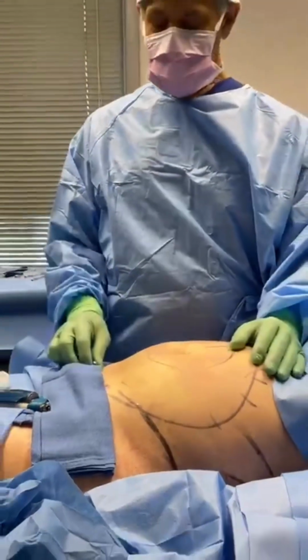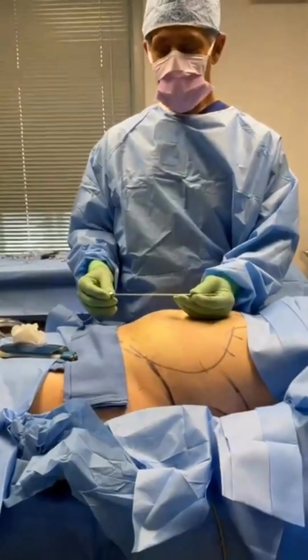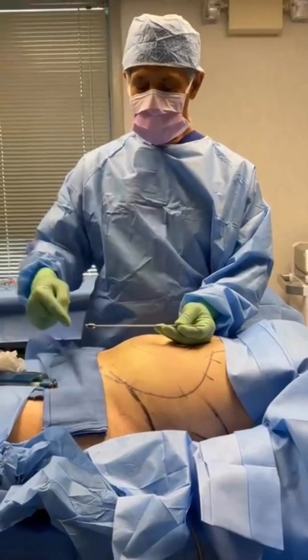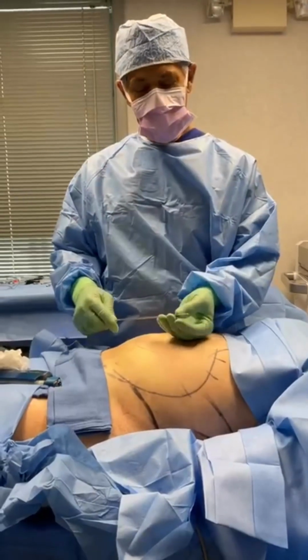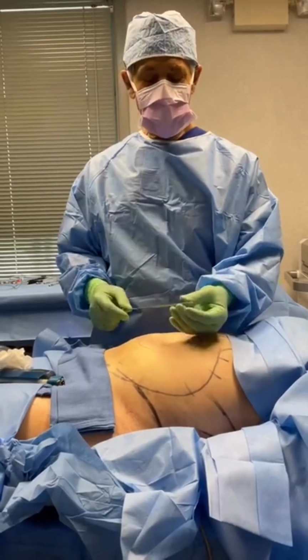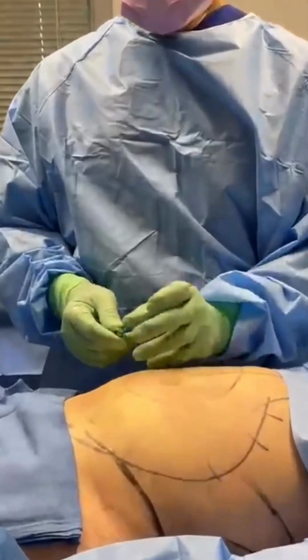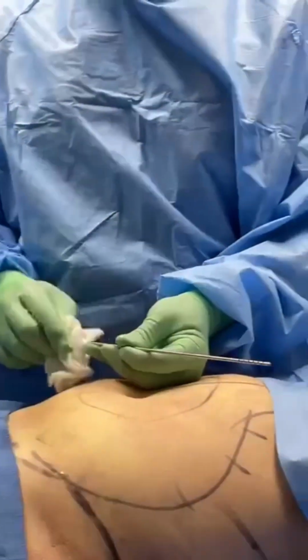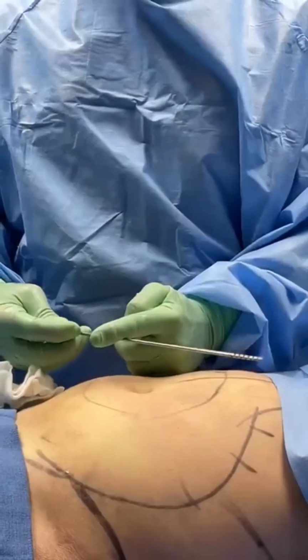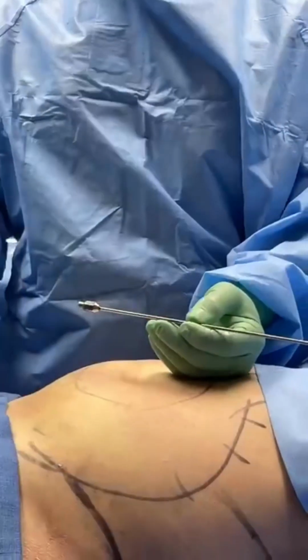All right. So this is one of many little devices that we can use as a straw to put our suction on and to then suck fat out through these tiny little holes. And I have many different kinds of these micro cannulas with different hole configurations and different diameters and different lengths. Some are very short and some are a little bit longer. This kind of a medium-sized cannula here.